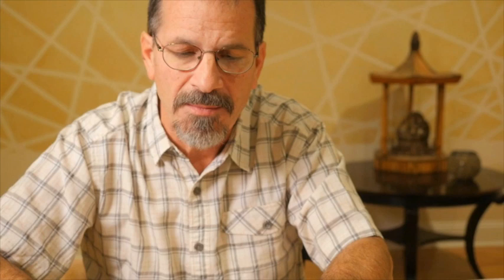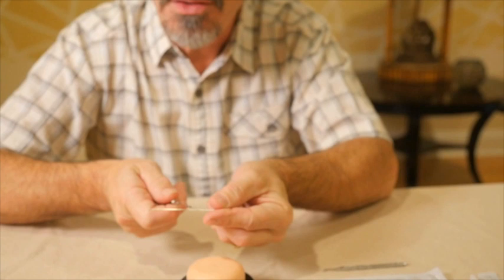That brings up the question of the different parts of the needle. There are basically two parts, but we talk about them as three parts of an acupuncture needle. There's the body or shaft of the needle, which is the actual needle itself. There's the handle, which will be either metal or plastic. And then there's the point of the needle.